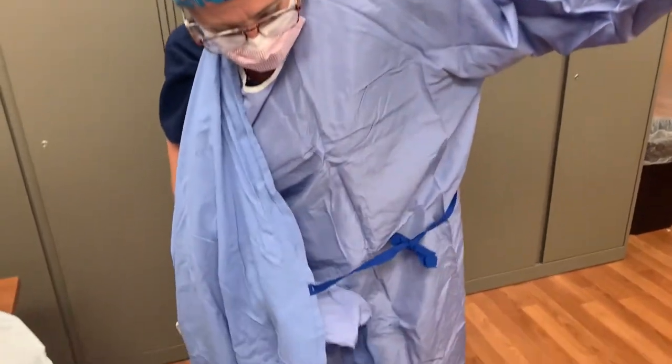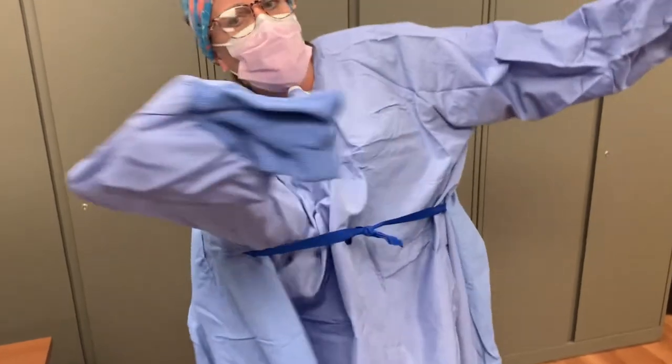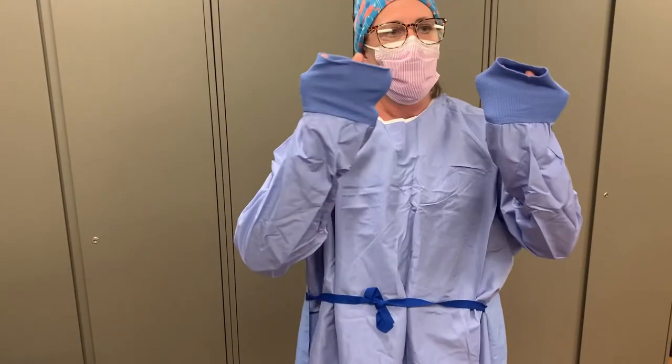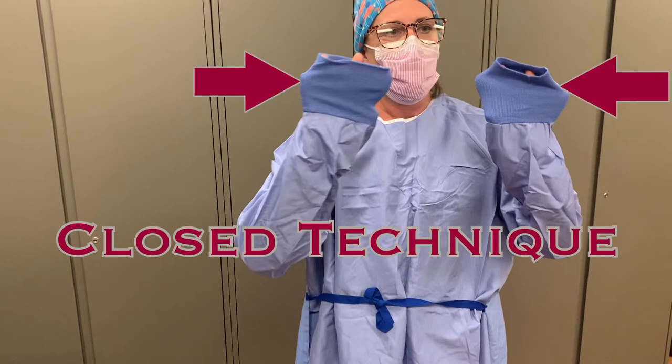While extending your arms into the sleeves, make sure your hands do not exit the sleeve. You are donning this gown and gloves in what is known as a closed technique, and the key to this technique is that your hands remain contained within the sterile gown until they are covered by sterile gloves.